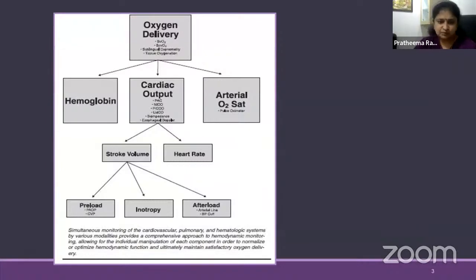We just plug it in and put the clip around the patient's finger, so oxygen saturation is continuously monitored. What we have to look into continuously is the cardiac output, because the heart is receiving blood and pumping. Is it working very well? So let's break it into even smaller pieces. Cardiac output, how do we monitor? We need to look into two things.